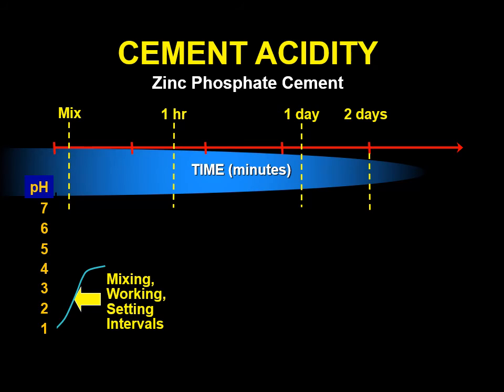At the start of the mix, it will increase to 2, and then it will increase with time. The pH will increase until it reaches neutrality after about 1 to 2 days.